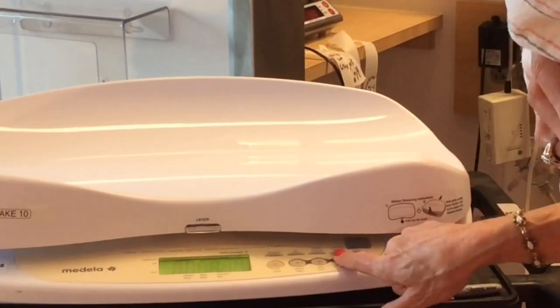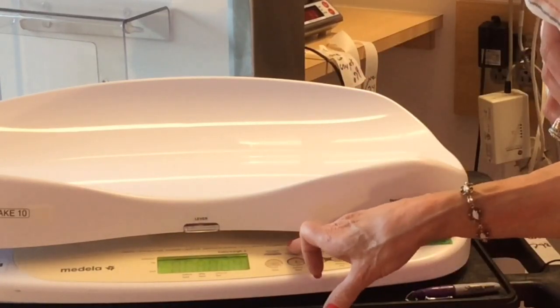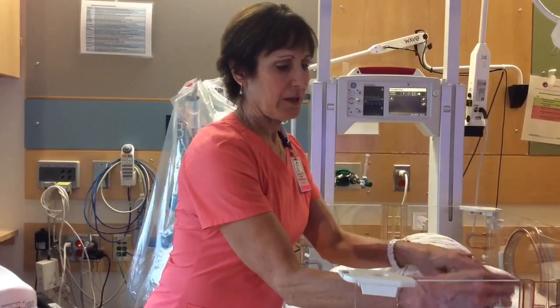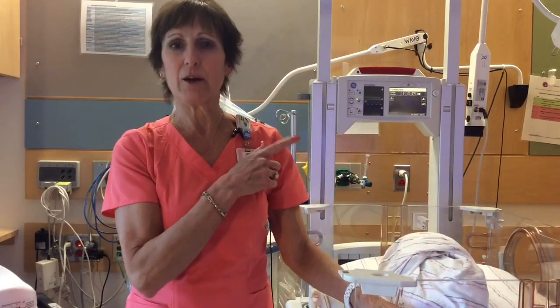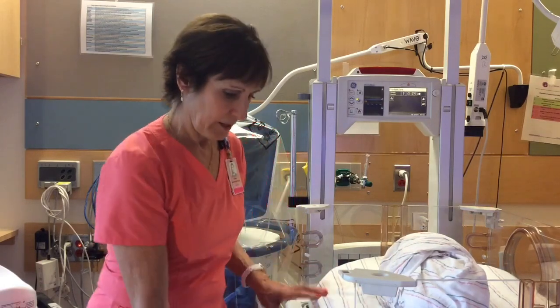Press the number 3 button to display the calculated intake. Then you would press the scale off when you are done. Put the baby back to bed. Connect your leads. Then you're going to write your calculated intake into Epic on that INO sheet. And that's it.